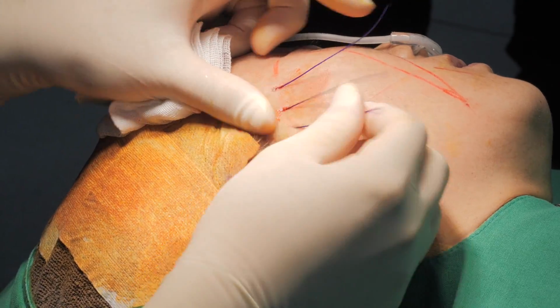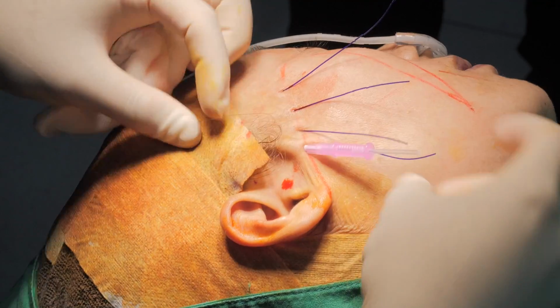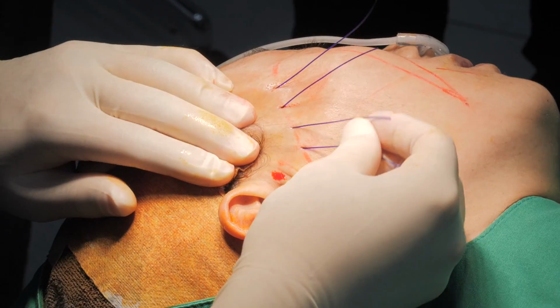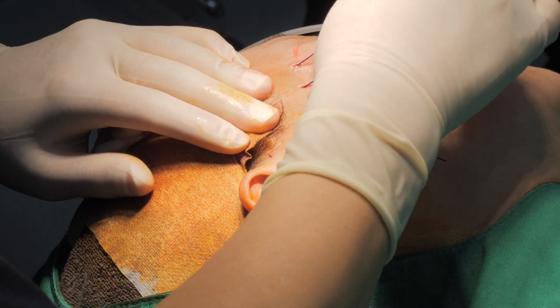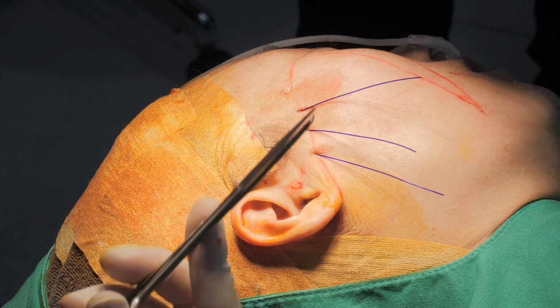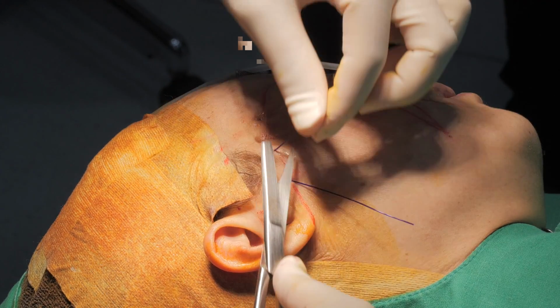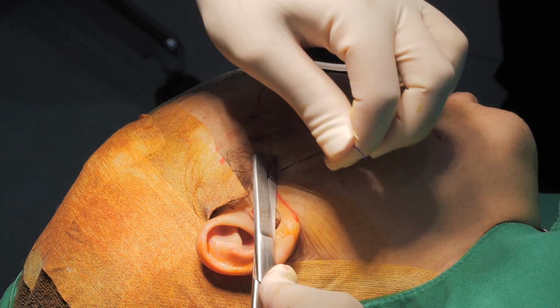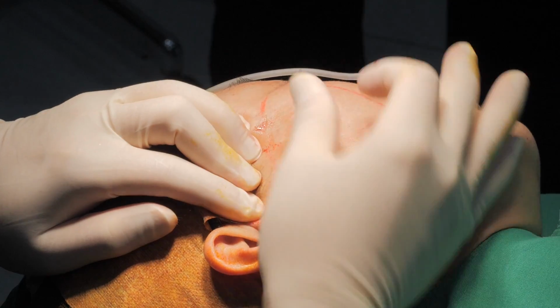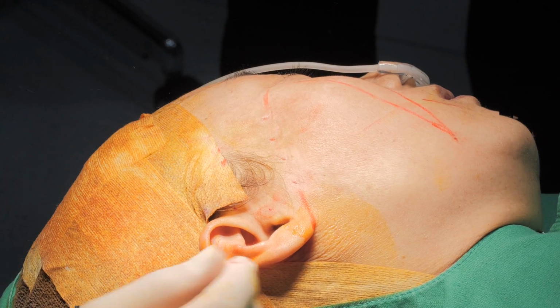Massive bleeding. Don't be upset. Don't panic. Just press that area for a moment. It stopped easily. Also the same. Simple. Pressing the skin with the scissors, but be careful not to cut the skin. Yes, sometimes we can make mistakes. We should restore the dimpling. Simple. Okay, but not enough.